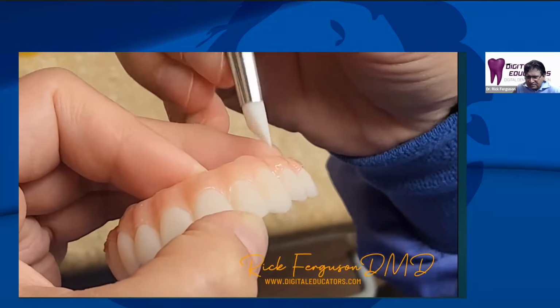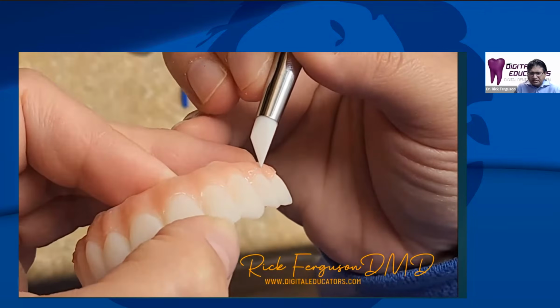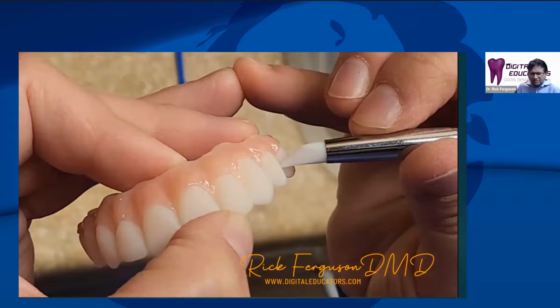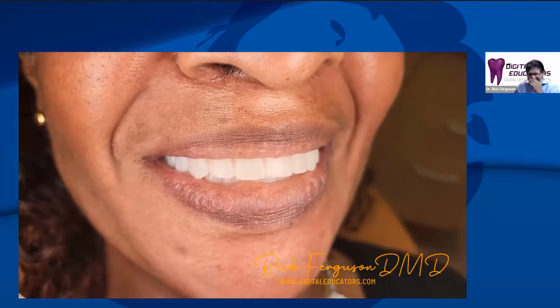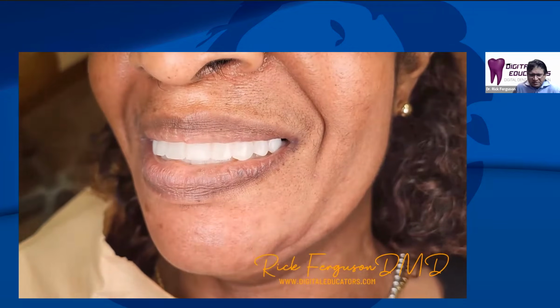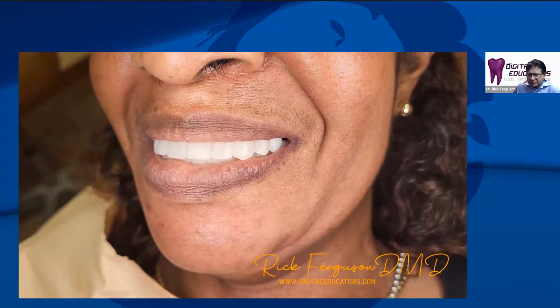And here's my assistant finishing up by adding the pink gum tissue after the print is processed and washed after it comes out of the printer. And then this is what it looks like delivered to the patient. So after the first prototype, this is the second prototype that we're able to design and finish. Now what we did here was I outsourced the design to a digital design lab, got that back, and used that to design this prosthetic, which again this one goes directly to the multi-unit.